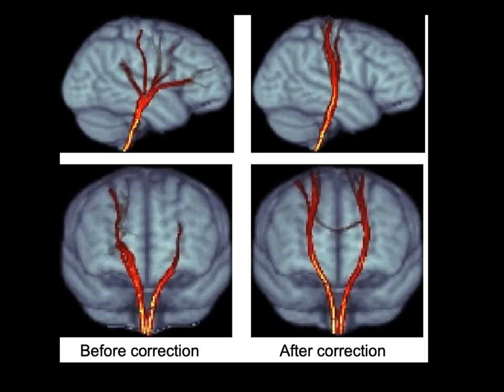So essentially, the take-home message is, even if you are not interested in diffusion tensor-based morphometry, but you are just interested in tractography, care about correcting the distortion in the echoplanar images that you used to compute your tensor. And this is another example of the consequences of not correcting it. So if you have distorted images, this is essentially probabilistic tractography in a population of subjects, seeding at the level of the brainstem and seeing where the tracks go.